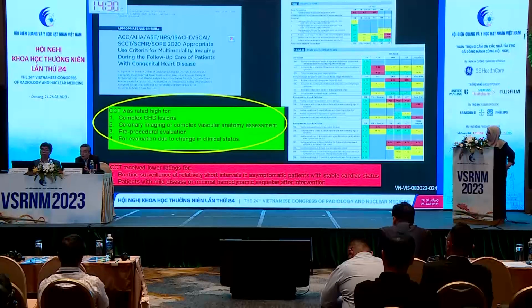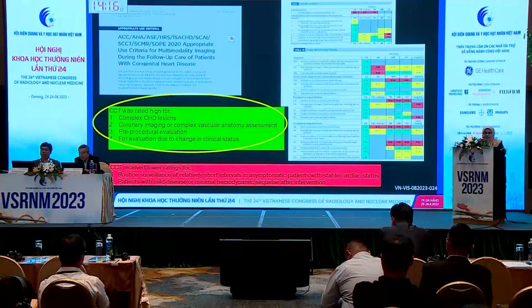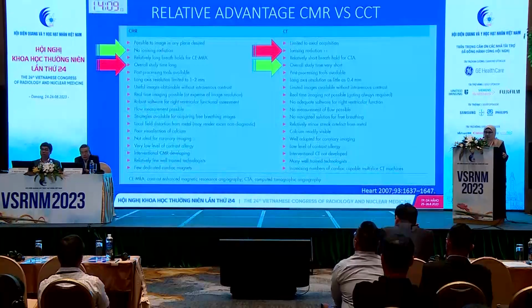However, the CT is rated low for conditions where you have routine surveillance at relatively short intervals in asymptomatic patients with stable cardiac status, and also patients with mild disease or minimal hemodynamic sequelae after intervention. So this kind of group, usually they will be subjected more to echocardiography.